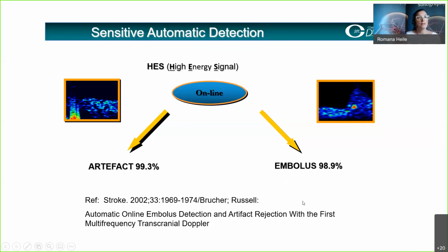So the question is always, why should we differentiate if it's not 100% reliable? Well, even if it's not 100%, it will still give a lot of useful information in specific application cases. Let's go back again to surgery cases, for instance, open heart surgery. In that case, we have 2 sources of emboli. We can have gaseous emboli caused by the on-pump situation if the patient is on a heart-lung machine during operation. And second, solid particles can be created by the operation technique itself.